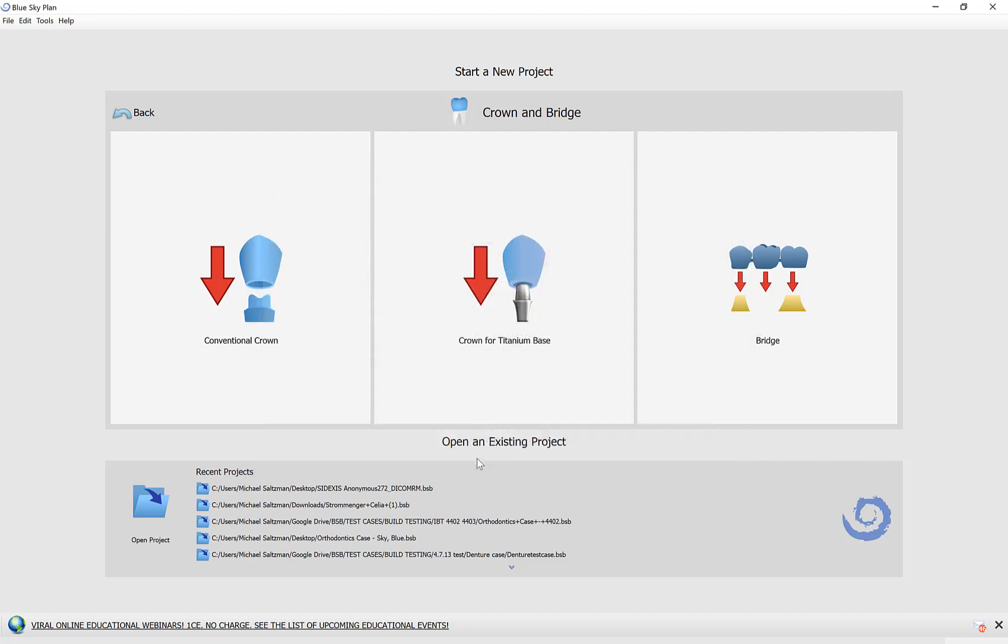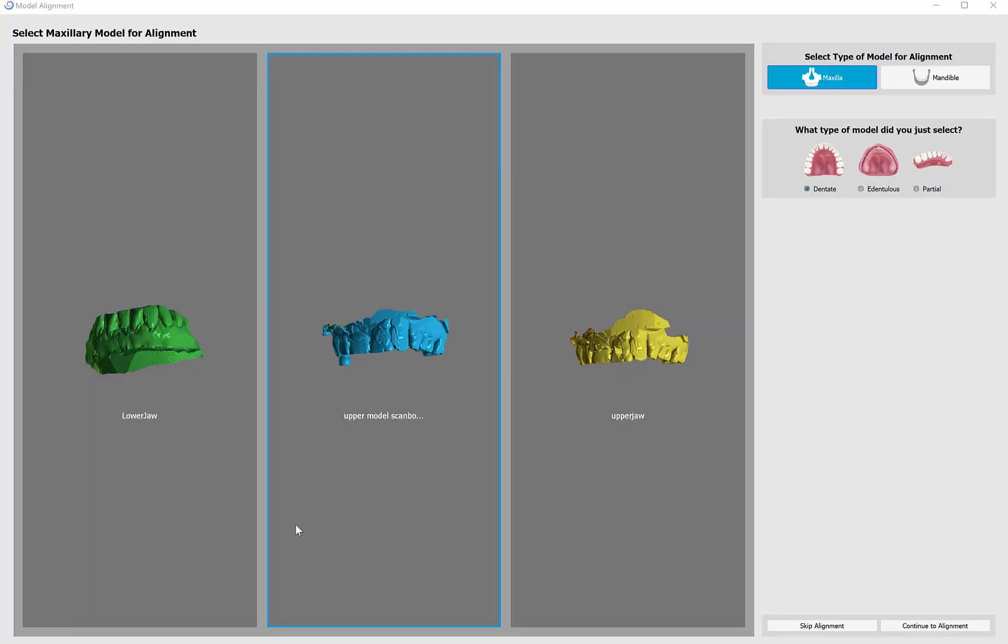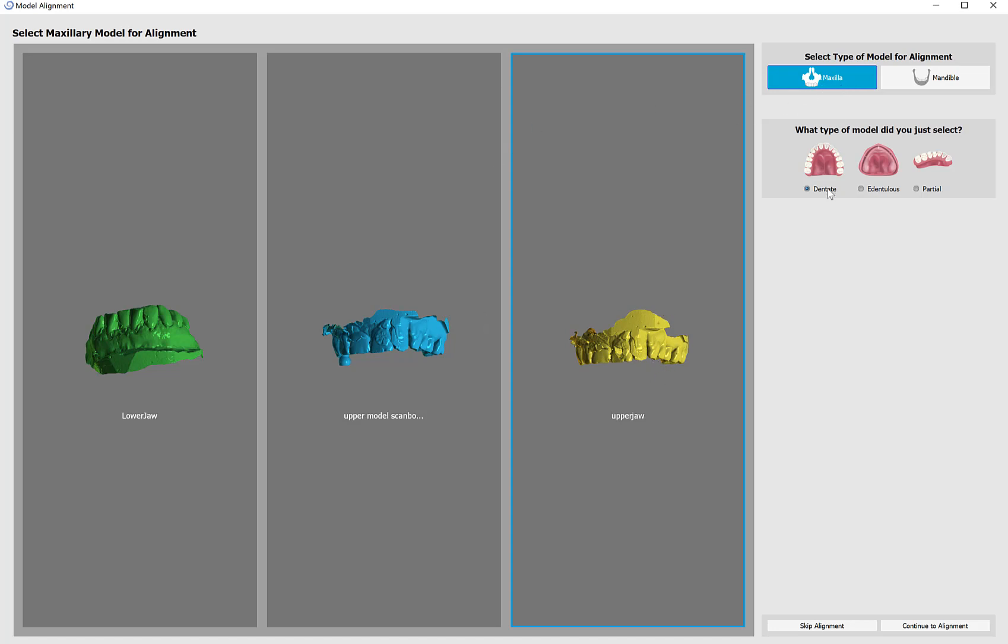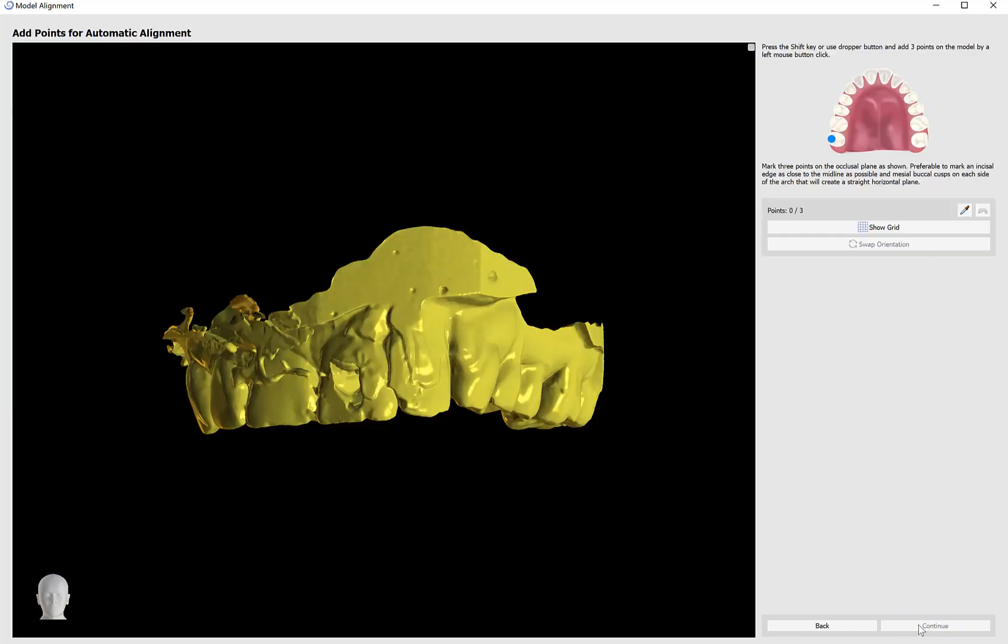Once I have them selected, I'll click OK and the software automatically brings up the model alignment screen. I'm going to left click to select the model on which I'm going to be designing the crown and then on the right side of the screen select the jaw type and the type of model it is dentate and on the bottom right continue to alignment.